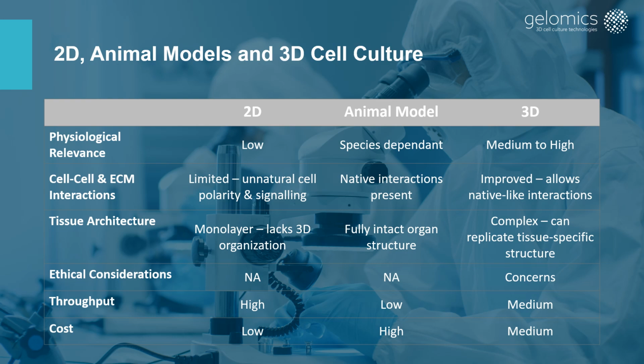Let's begin by recapping what 3D cell culture is and discussing why it is becoming an essential tool in biomedical research. 3D cell culture is an advanced technique in cell biology which allows cells to grow in a more realistic microenvironment, complete with cell-cell and cell-matrix interactions. Unlike 2D culture, where cells grow in a monolayer with limited spatial context, 3D culture enables cells to grow in three-dimensional structures, providing a more physiologically relevant representation of how cells behave in vivo.